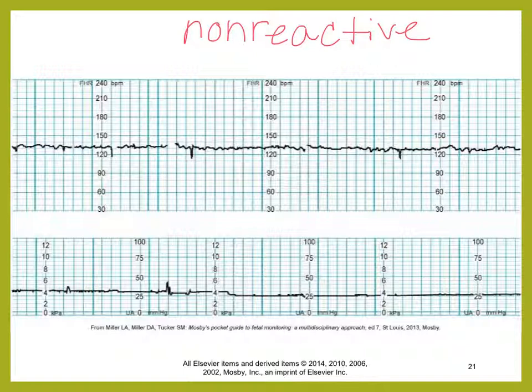We are looking for 2 accelerations in 20 minutes, and they have to last for 15 seconds. Here is movement, and there is no increase or anything you see different in baby's heart rate. It is staying pretty much a nice steady baseline heart rate. You do not see any peaks with the movement. Non-reactive. We don't want non-reactive.